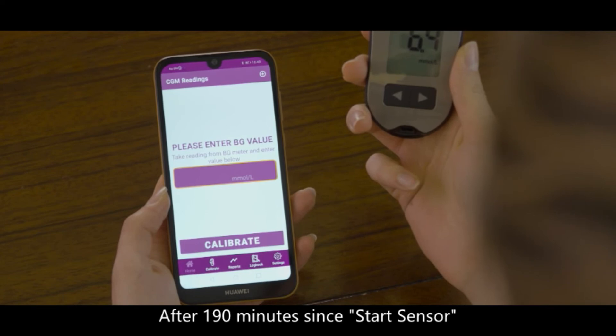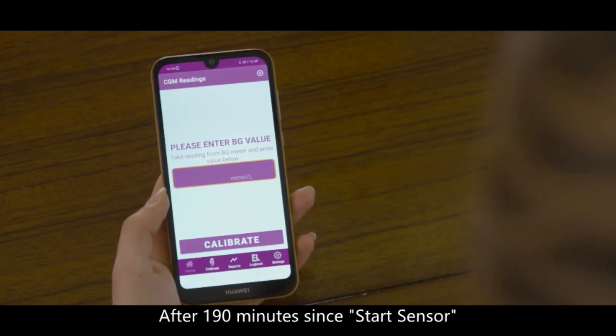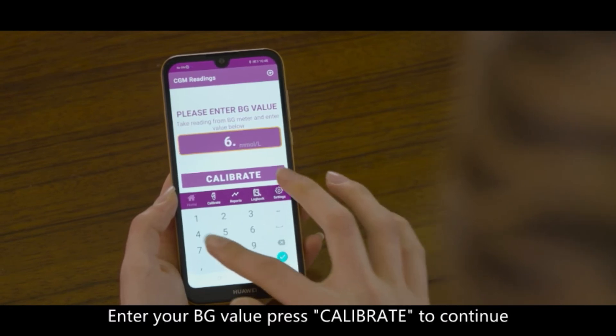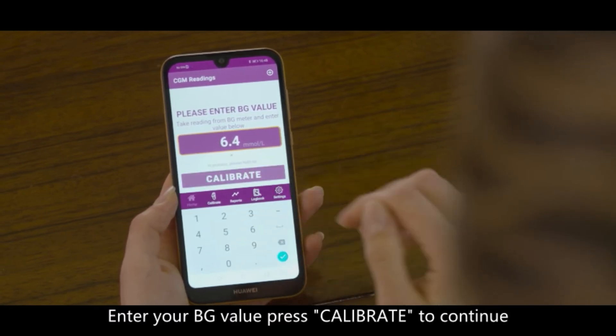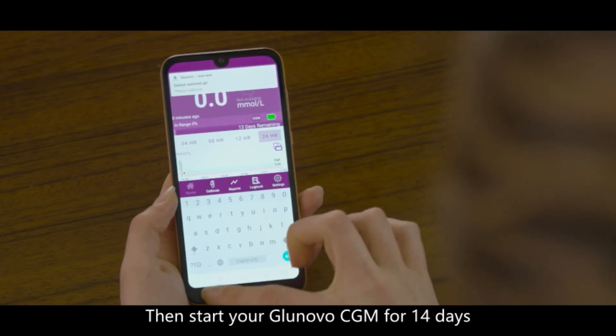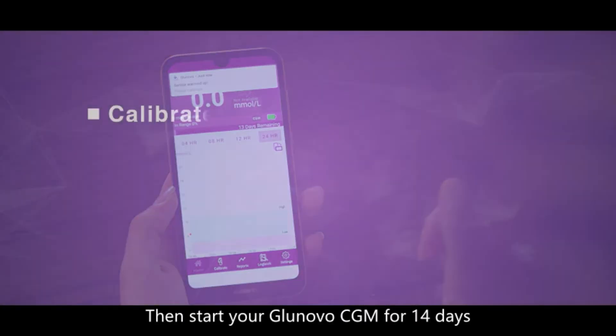After 190 minutes since starting the sensor, warm-up is completed. Enter your blood glucose value and press Calibrate to continue. Then start your GluNovo CGM for 14 days.